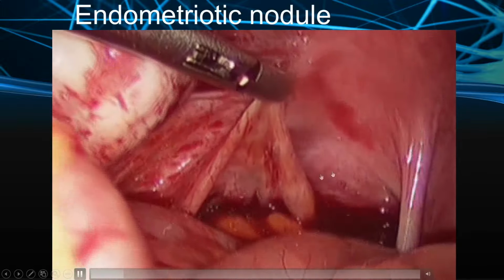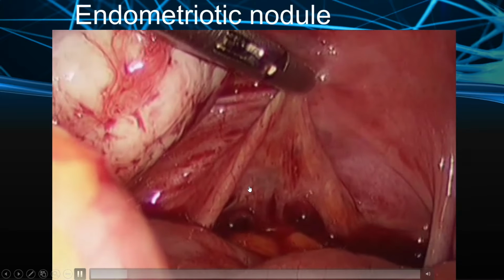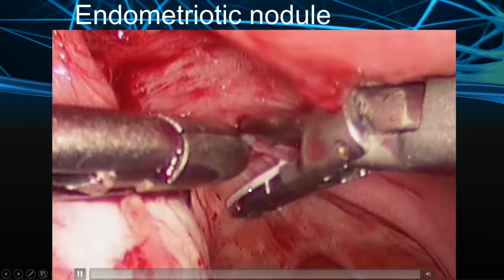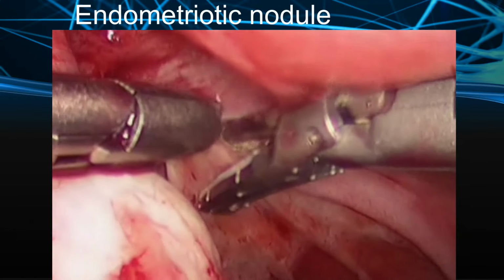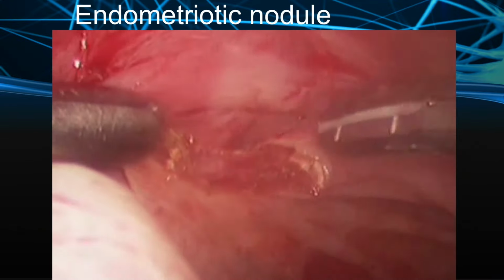So, the patient's main concern is not the infertility. The patient's main concern is the pain. So, what you can do, you can strip the peritoneum with the harmonic and the deep nodules can be taken out. Together you can also do LUNA, you can burn the uterosacral and you can remove these.